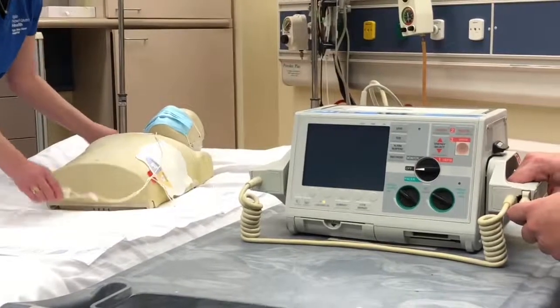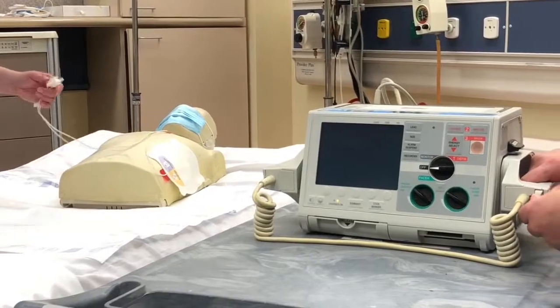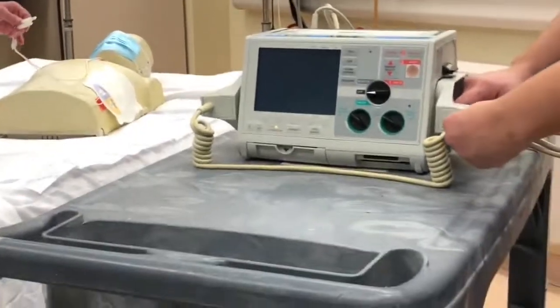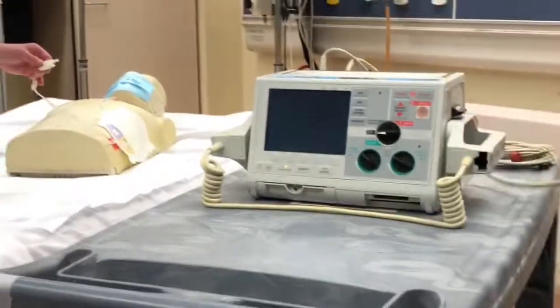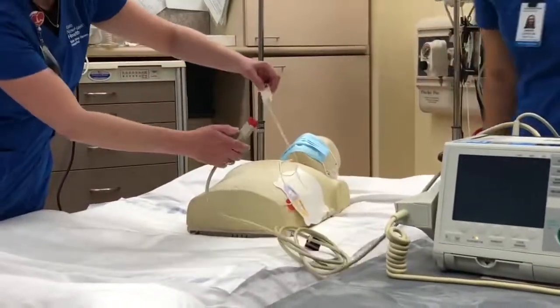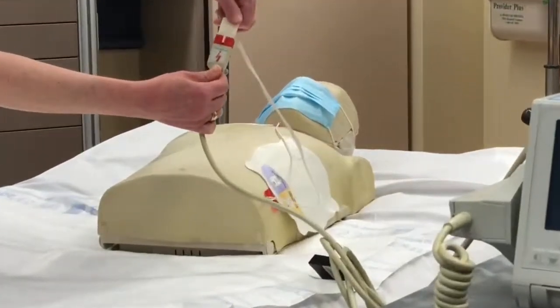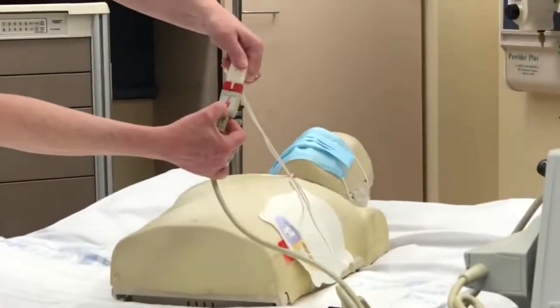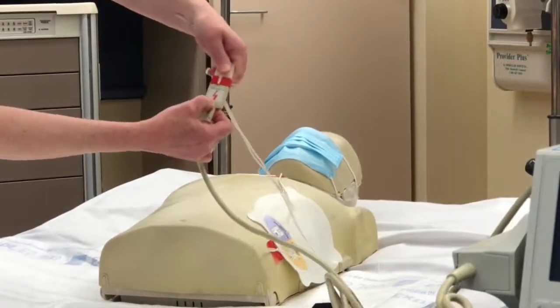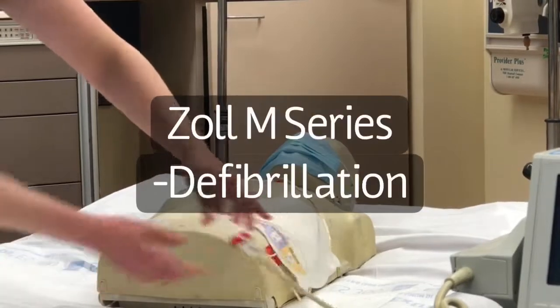At the end of the pads is your connection to the Zoll M-Series, and we are going to connect the pads to the multifunction cable, often housed in the paddles. You'll make sure that your pads are connected. This side up, look for your lightning bolt or your shock symbol, and this clip connects the pads to the defibrillator.